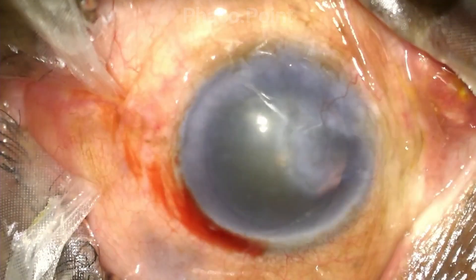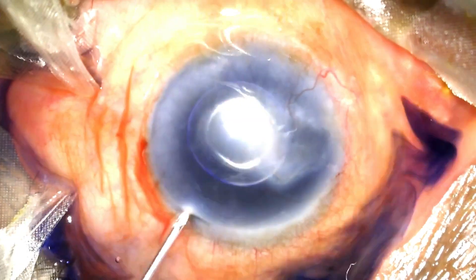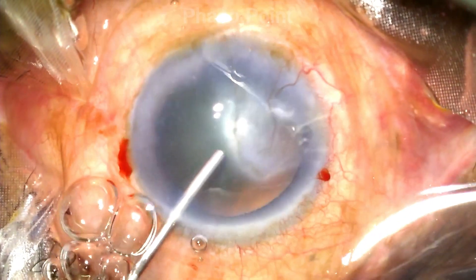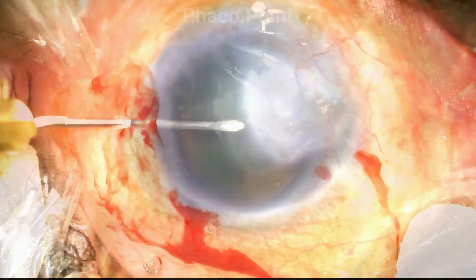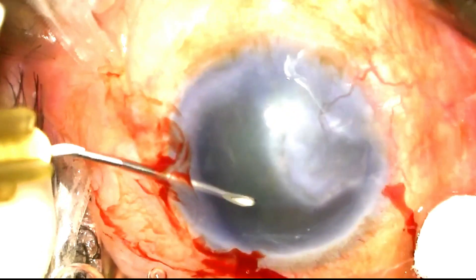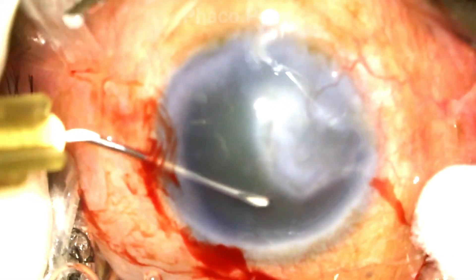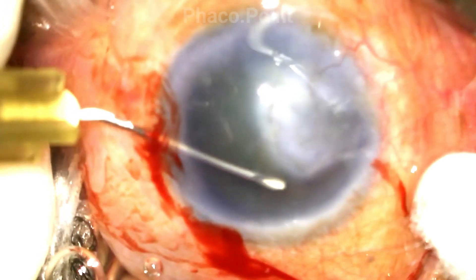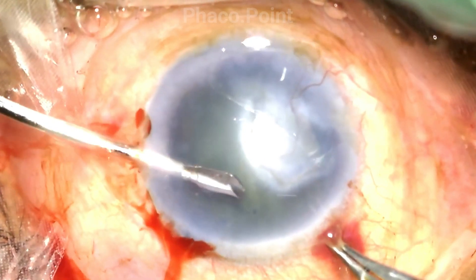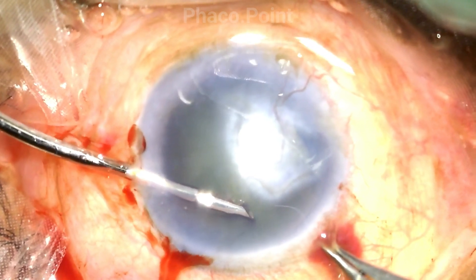It is important to take adequate time to allow for proper staining of the anterior capsule, as this aids visibility while performing the capsulorhexis. We need to ensure good illumination, high magnification, and perfect focus on the anterior capsule prior to performing the capsulorhexis.